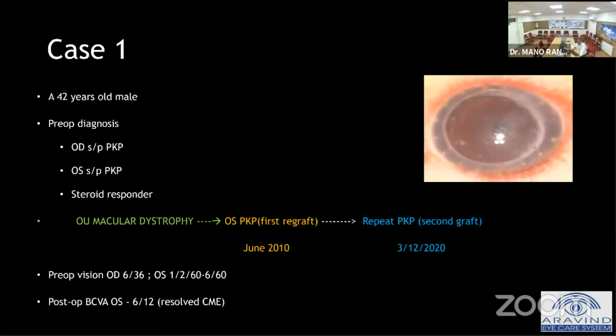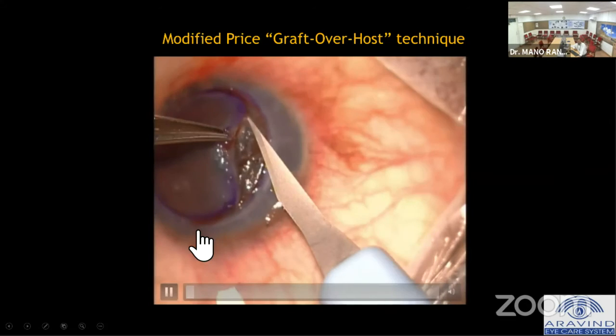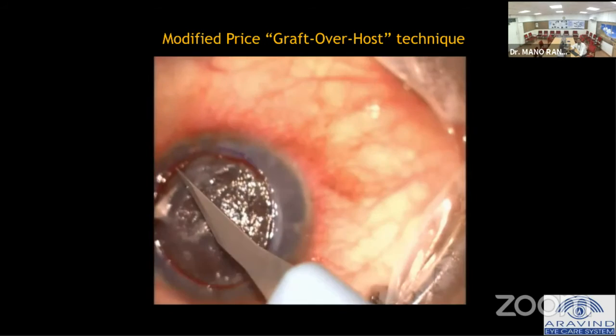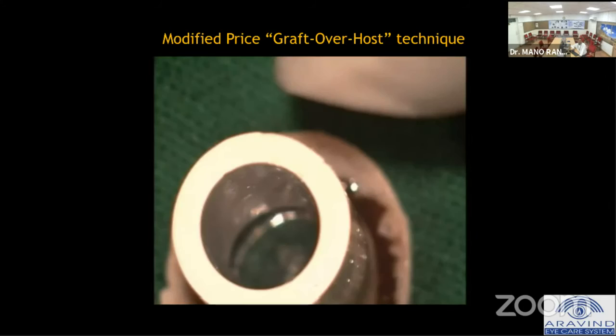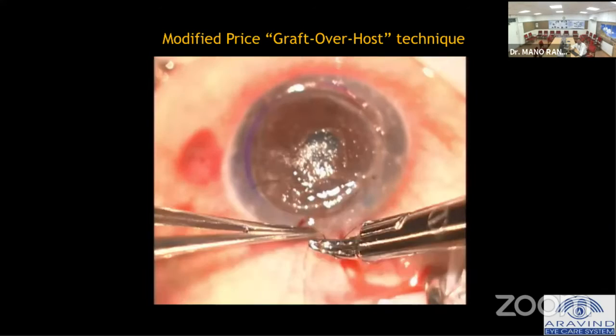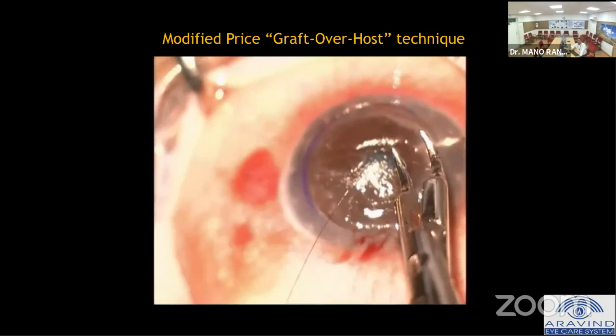This is a case of bilateral macular corneal dystrophy, and the left eye presented to us with a failed graft with secondary glaucoma. This is how we managed the case. You can see after the proper block, I have modified this technique to take an anterior 70 to 80% stromal debulking. After the debulking, reassessment of the graft size is done, and then after slow entry, I cut the 3 to 4 clock hours of residual cornea and put the sutures on the non-cardinal side.